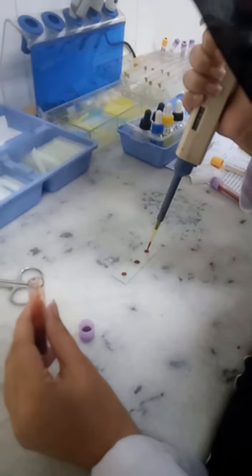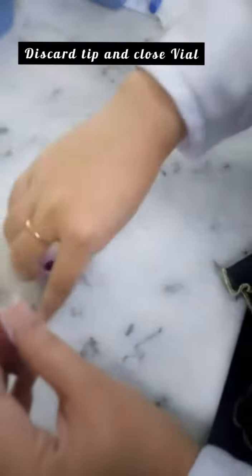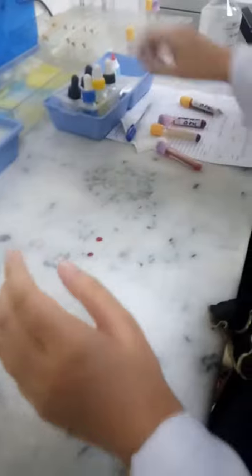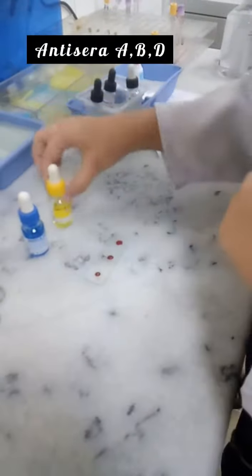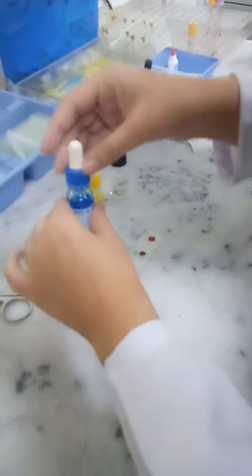We are done with that. Now we need to discard the tip of the pipette and close the vial. Now take out the antisera — this is anti-sera A, anti-sera B, and anti-sera D. The blue one is anti-sera A.